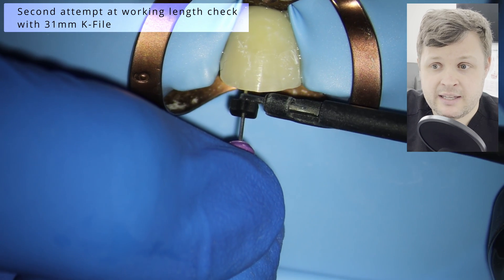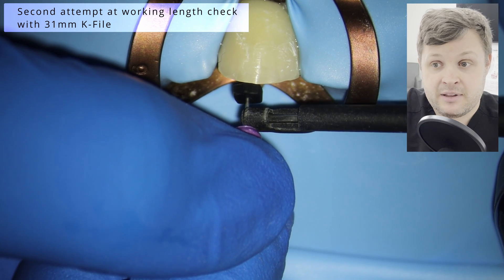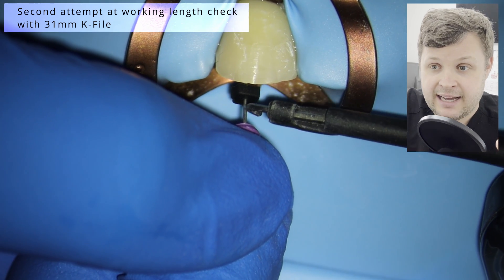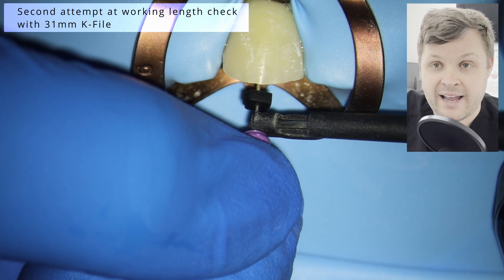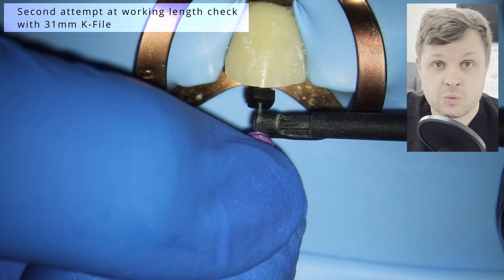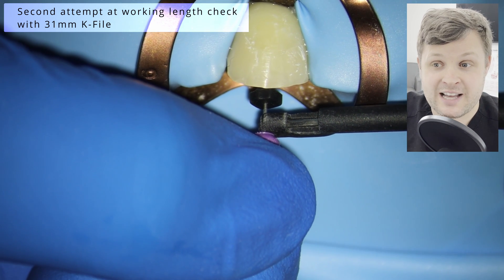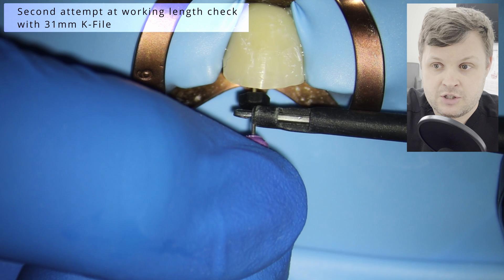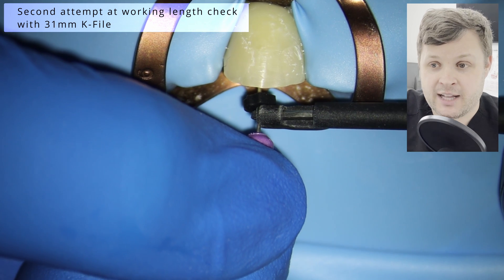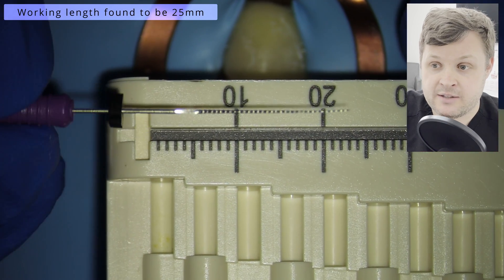Sometimes with really wide canals it can be very difficult to get an accurate working length. Some would argue a size 10 file is probably too thin to correctly gauge the working length, and if you've got a size 10 in a large canal and the apex locator is going wild everywhere, it might be a good idea to step up the diameter to a 15 or even a 20 — this has been shown to give more accurate readings. We found the working length is 25.